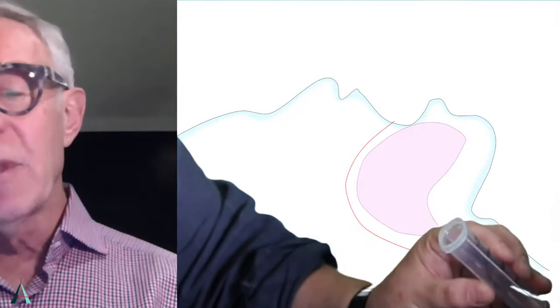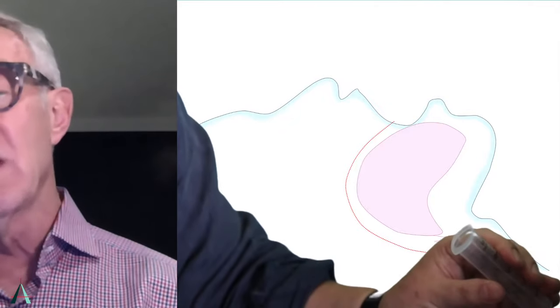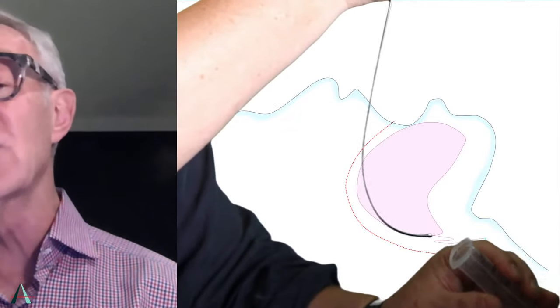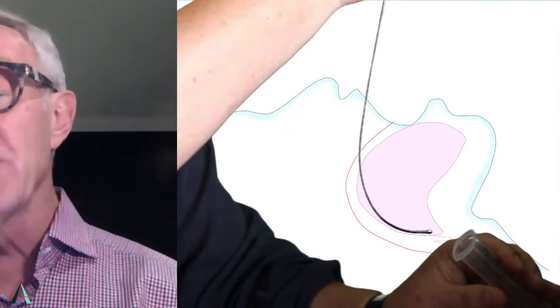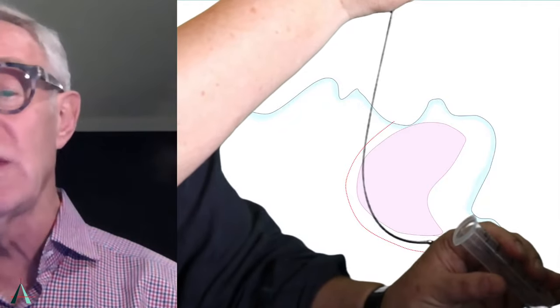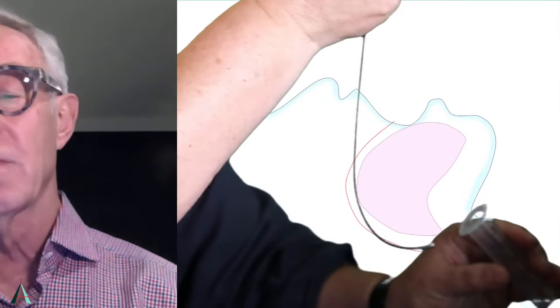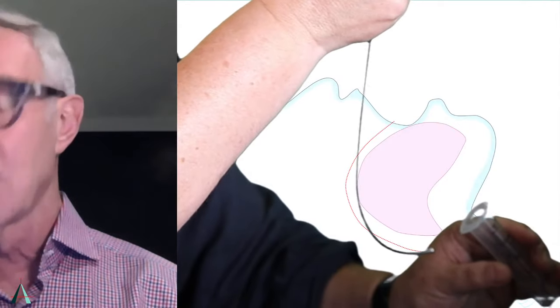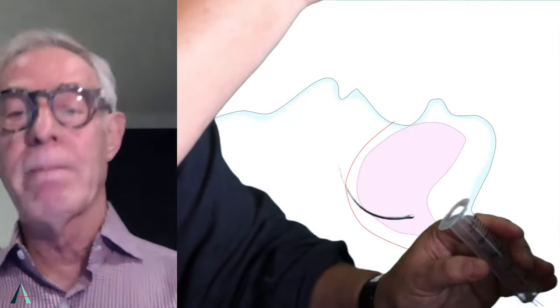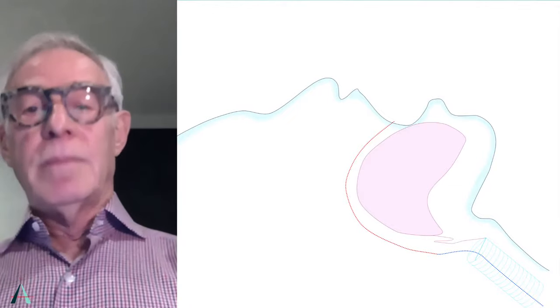That's absolutely right, Nick. But there's one other reason for doing that. You can't angle the right hand because you've got the maxilla there, so your ability to manipulate that endotracheal tube is very limited. If you simply pull upwards, maybe 1 centimeter or so, that's all you need to do. I see. So if you're down here, to get forwards you start getting restricted by hitting the upper teeth. But if you pull up, you get that elevation relative to the larynx without impacting on the teeth. Exactly. Fantastic.